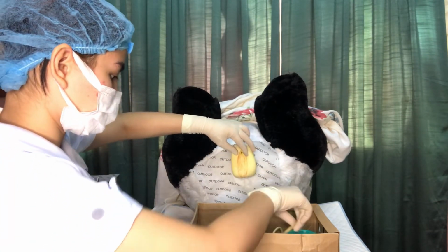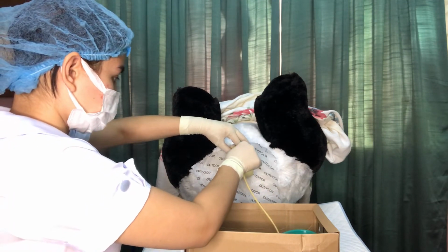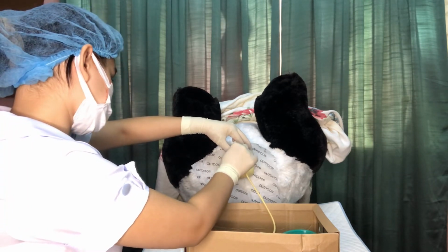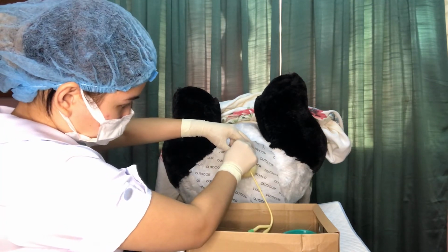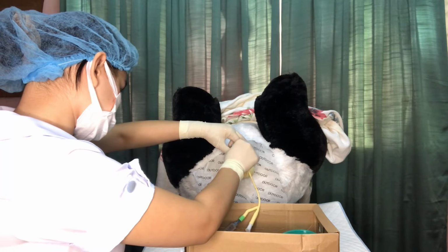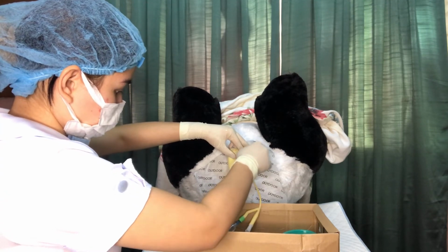Introduce a well-lubricated catheter 5 to 7 cm into the urethral meatus using strict aseptic technique. Place the drainage end of the catheter in the urine receptacle. Hold the insertion end of the catheter about 5 cm from the insertion tip with the uncontaminated sterile gloved hand. Allow some urine to flow before collecting a specimen. So lubricating the catheter is very important because this will give us an easy way to insert the catheter without causing any pain.